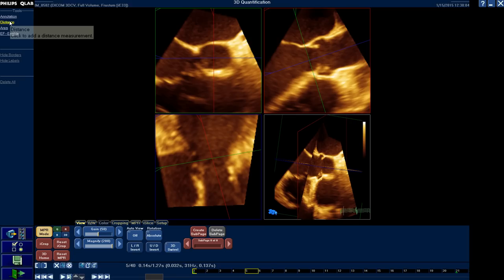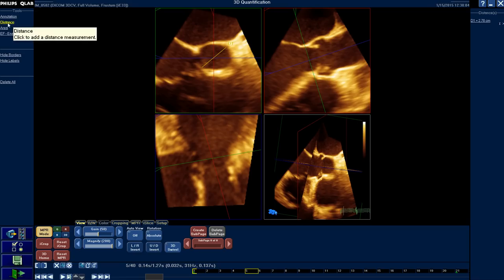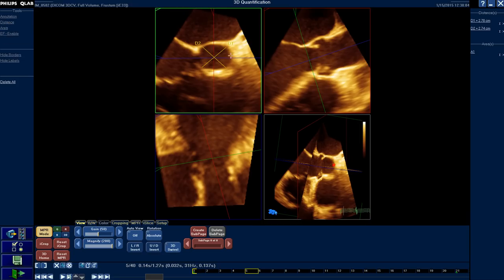From this view, I can use the software to measure distances, either maximum and minimum, as you can see here. Or I can use the area tracing method to trace it. So now I have the annulus dimension with very good accuracy on the en-face view.